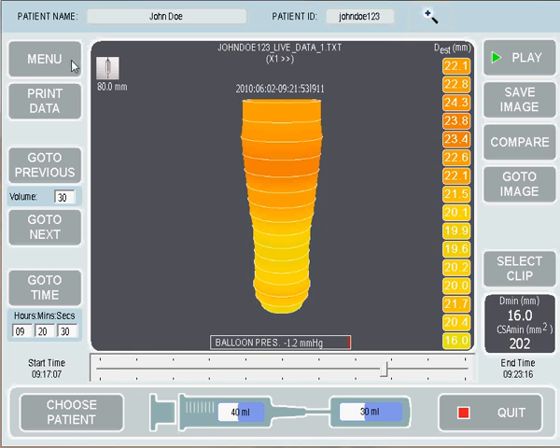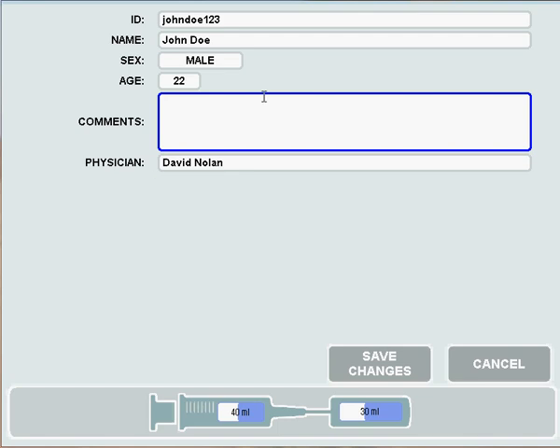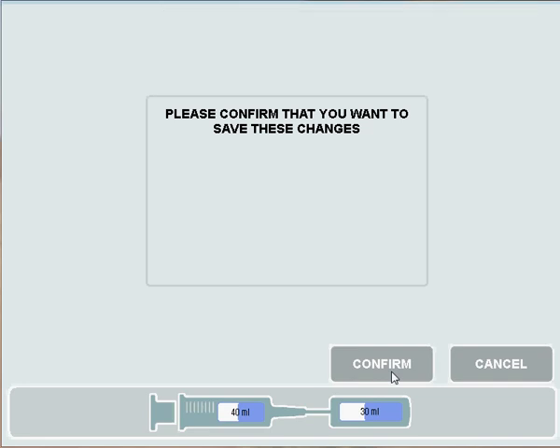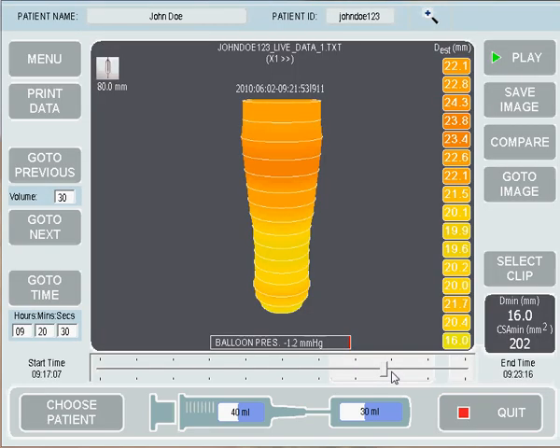Finally, in our menu there are two options we haven't discussed: User Preferences and Change Patient Details. Change Patient Details can be used to change the patient's details — you can change everything apart from the patient ID, which cannot be changed. If you make any changes, you press the Save Changes button, confirm those changes, and be brought back to the main screen.